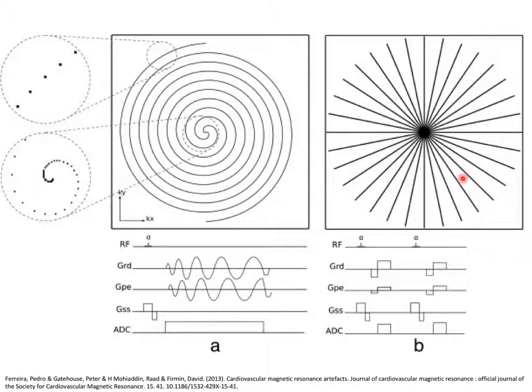You can see that there's an issue with radial sampling in that you get many, many data samples close to this point in the raw data space, and this is the origin or the center of K-space, or the DC value. So you're oversampled at the low frequencies and you're undersampled out at high spatial frequencies. This has obviously a very strong cousin in CT imaging, right?